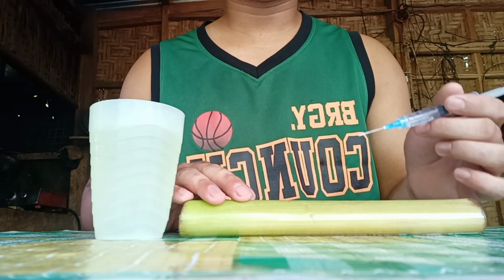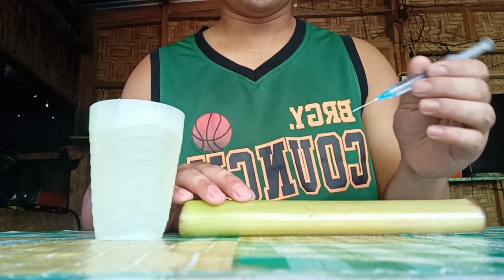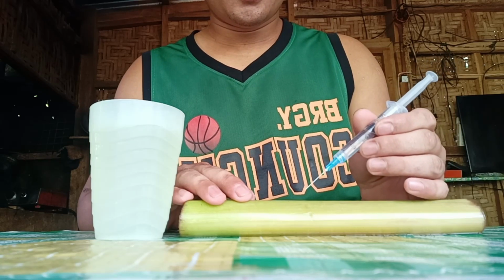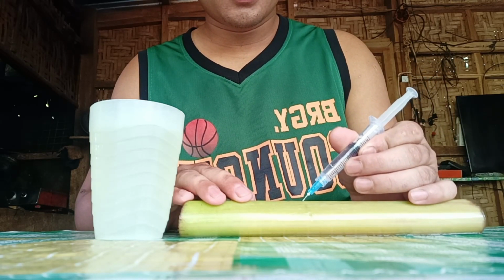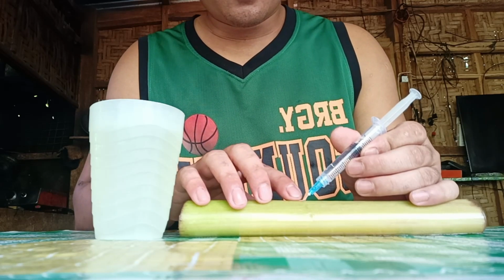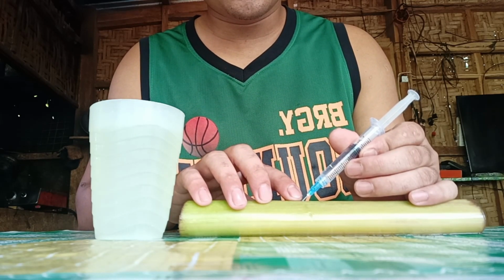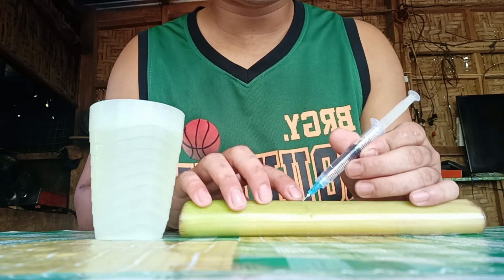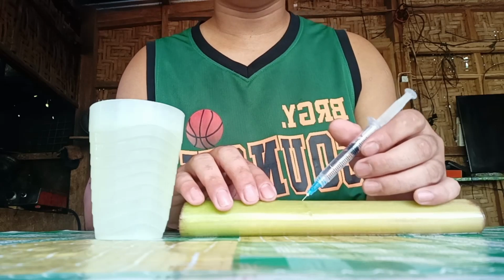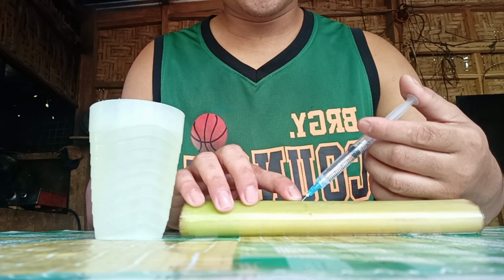The angle of injecting subcutaneous injection is 45 degrees. So inject it like this. Do not inject the full syringe into the tissue of the animal, so that the syringe will only reach the subcutaneous tissues that we need to reach. This is enough.